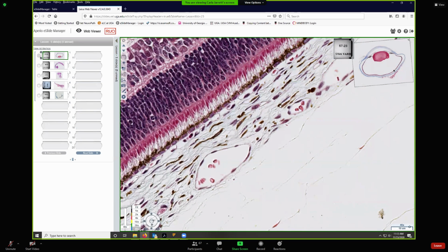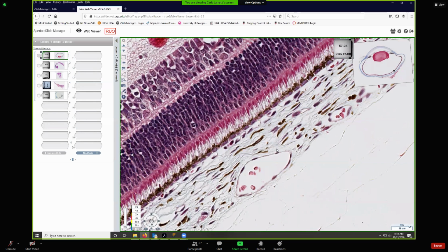The vascular layer, think of it as kind of like the stroma of the choroid. Then you've got your choriocapillary layer right here. And then this is the pigmented epithelium, retinal pigmented epithelium. Between that choriocapillary layer and that retinal pigmented epithelium is called the basal complex. That's a specialized basement membrane that is shared between the capillary bed and the retinal pigmented epithelium.